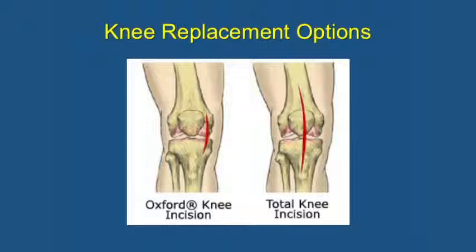How dense is the poly? Biomechanically, it's rock solid, it's dense, it's an ultra-high molecular weight polyethylene. I can talk to you more about that later. I'll get you Steve Kurtz's name, and we'll let you have fun with him. But this poly is not soft, in other words. It's very rigid, firm. It's pretty high density, absolutely. We need it to be that way biomechanically.